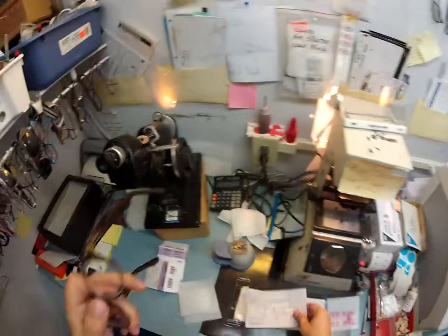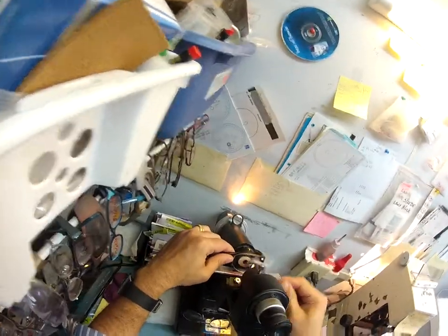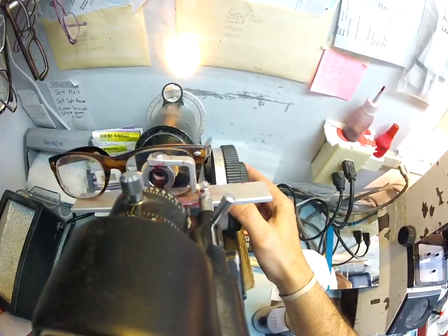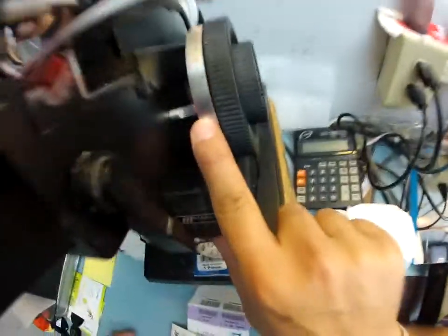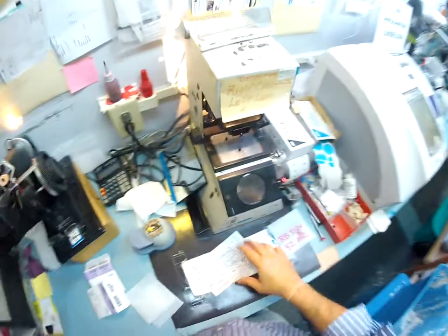-1, -50 at 76. I'm going to spin the axis wheel back to 76 to make sure everything is oriented just perfectly. Put that in there. And I'm getting -1 in the red. The plus numbers are in black. -1 in red. 2 steps of astigmatism, so we're at -150, which is halfway between 1 and 2. Hopefully the GoPro camera will see that.